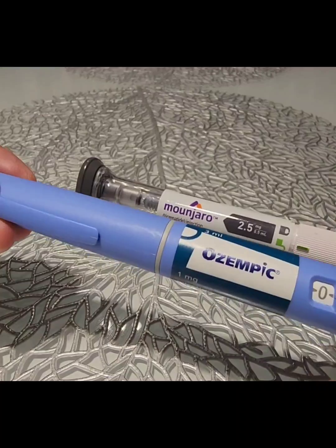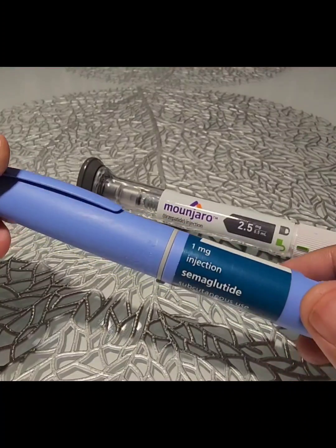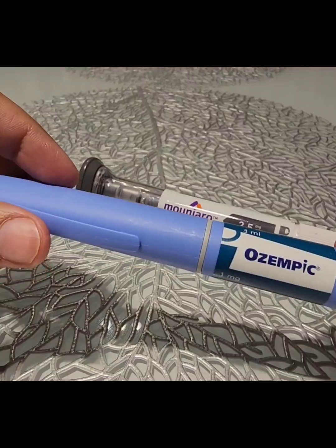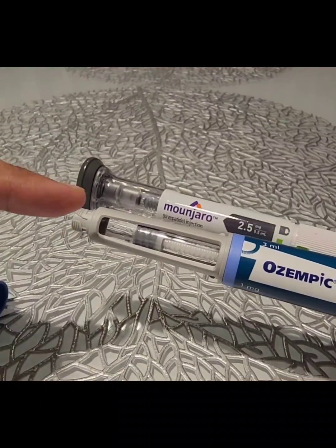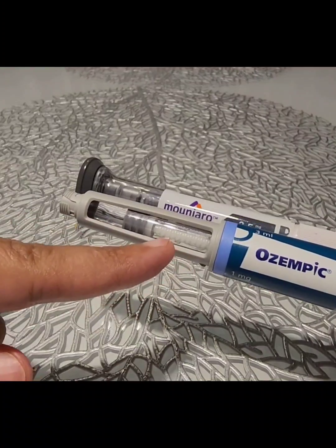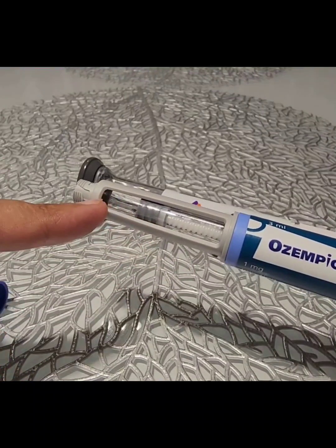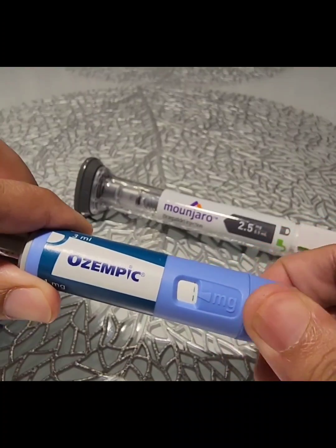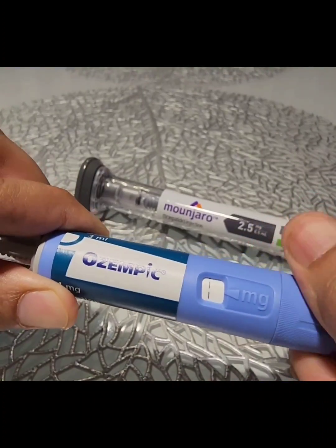As far as Ozempic is concerned, we have got this type of pen device and a whole month's supply is present in a single pen. This single pen will give the whole month's supply — there are four weekly dosages in this injection. When you are injecting, you have to dial the back of the pen like this all the way to the end.